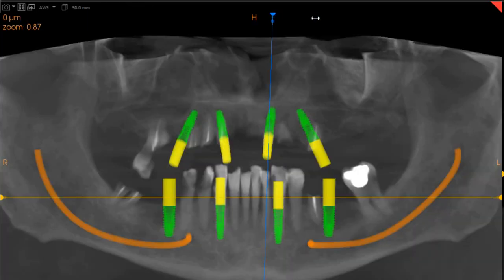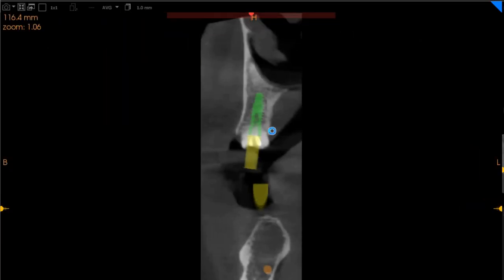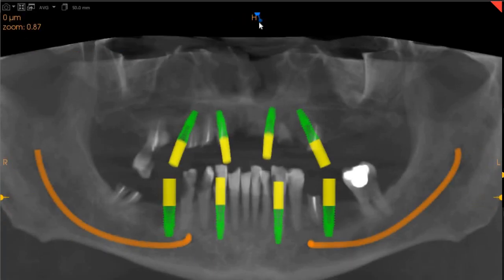Moving to the upper left posterior implant, which is in the premolar region, we've placed them at an angle because of the sinus, which is pneumatized distal to the 5 region. Here also we've got good bone, 8 millimeters of ridge width with 15 millimeters of height. All bone in the upper maxilla is relatively D3 to D4.